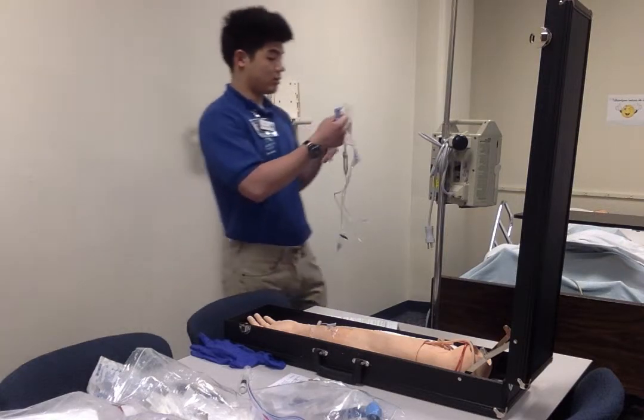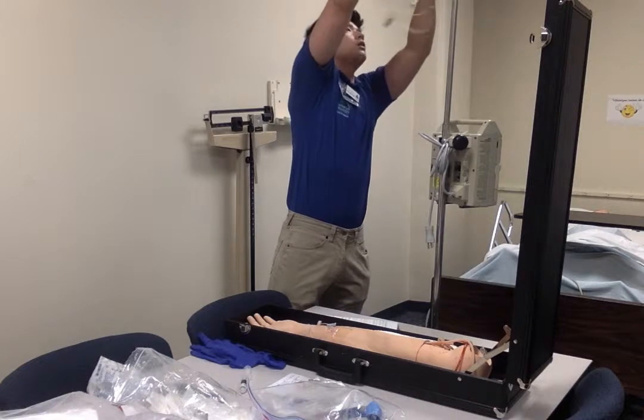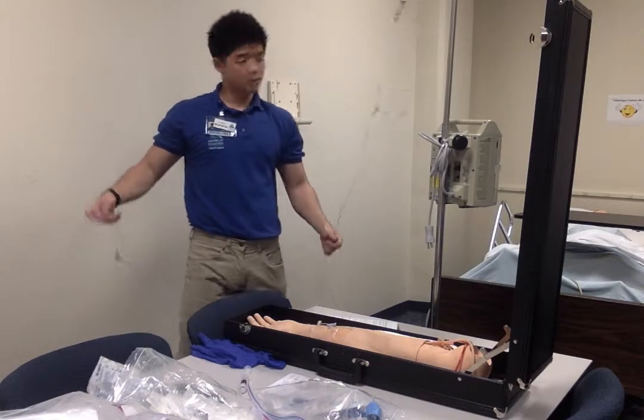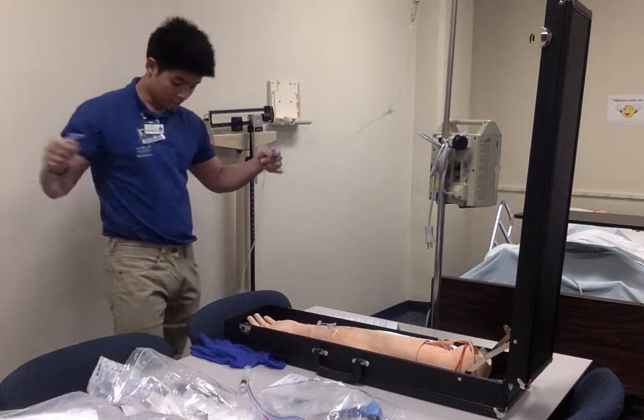And first thing I'm going to do is prime the bag. Okay. This is sterile, so you got to be careful.